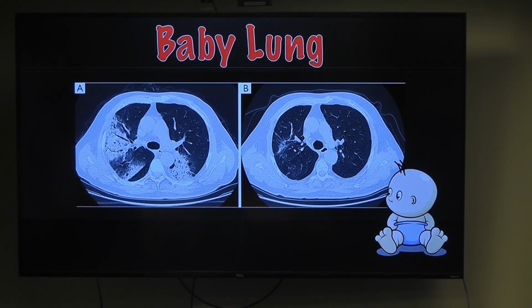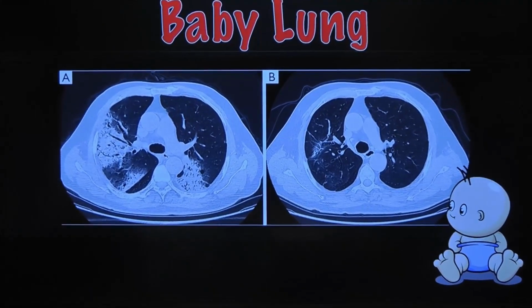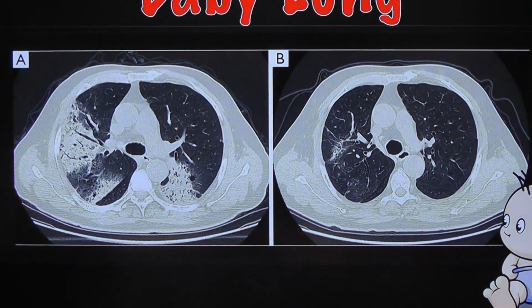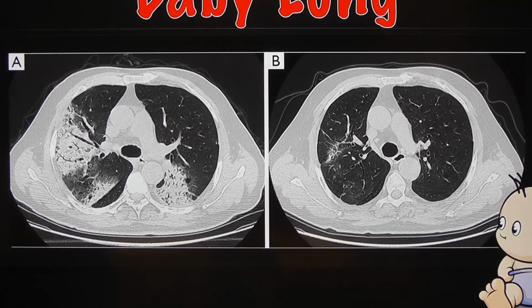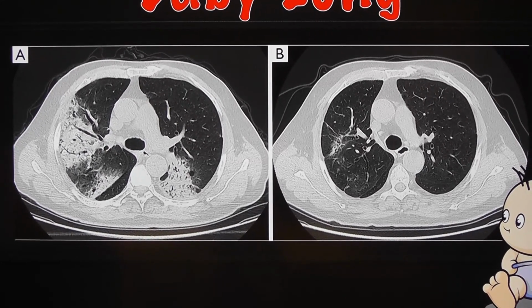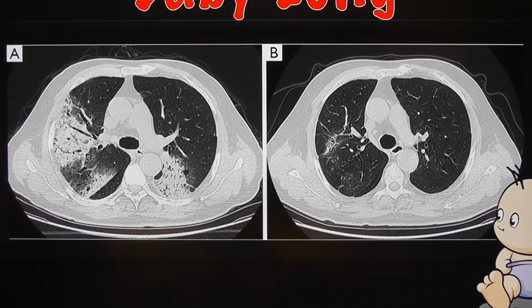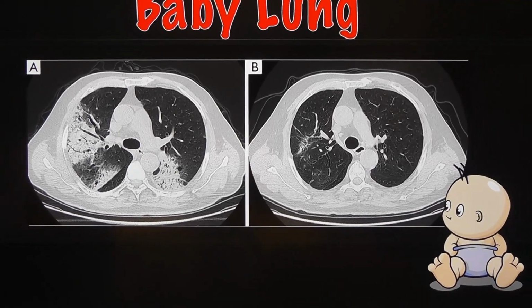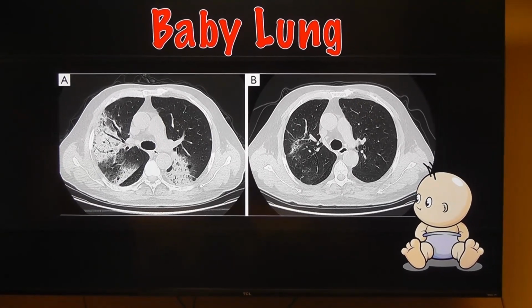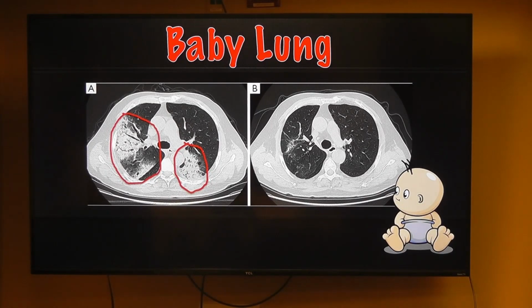The CT scan on the right is healthy lung. All of that lung is contributing to gas exchange. The problem is, the lung on the left, lung A, is atelectatic. That's your pneumonia. If I try and put the same amount of gas into lung A as I put into lung B, it's going to over-distend the areas that are actually achieving gas exchange. So then, the good section of the lung is going to start to look like that bad section of the lung. Okay? So we have to compensate for the sections of the lung that aren't contributing to gas exchange.